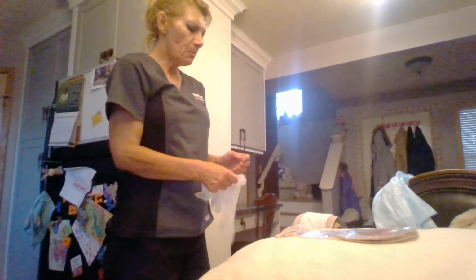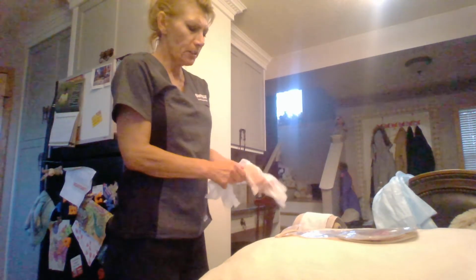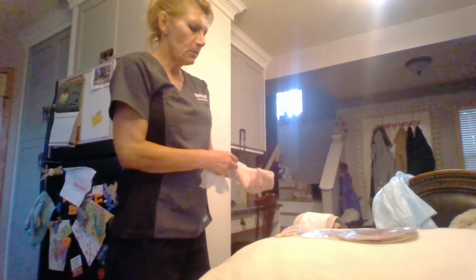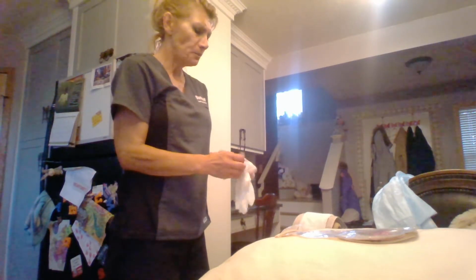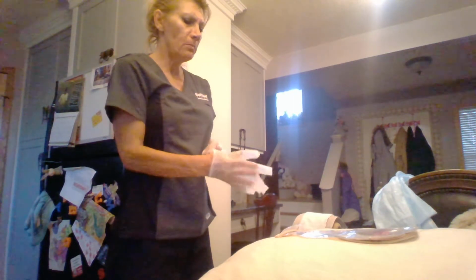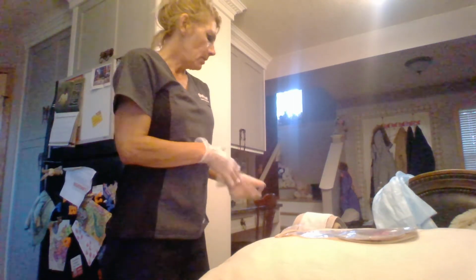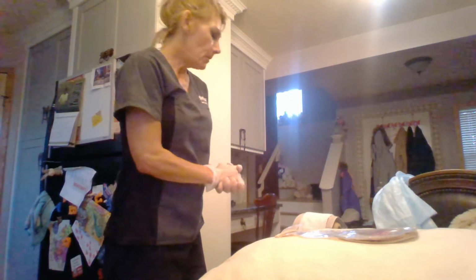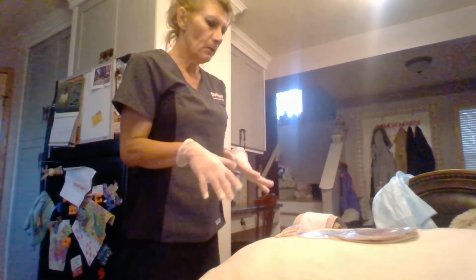So right now our brakes on the bed have been checked. The brakes are all fine. The bed rails are up. I'm going to let the bed rail down on the side in which I'm working. I've cleaned and sanitized my hands. I have checked my equipment. I have checked the bag system that I have. It's the proper system.